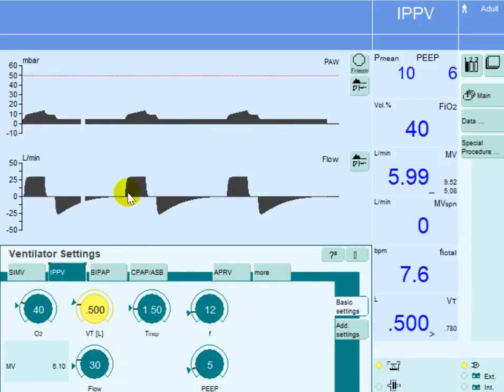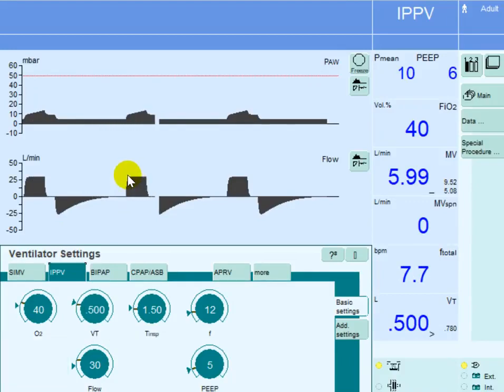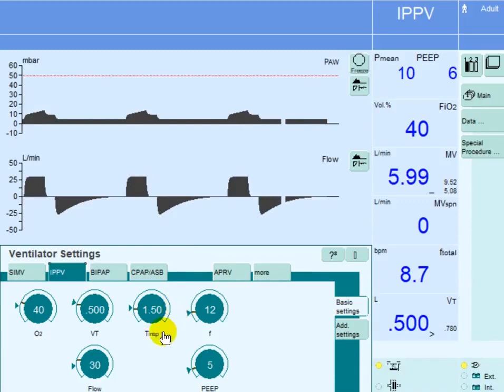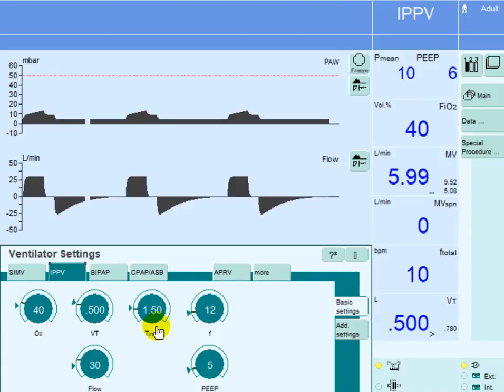The flow will go up to 30 liters and will stay at 30 liters for the duration of the inspiratory flow time. We set the cycling mechanism as time, and the inspiratory time here is 1.5 seconds, meaning that inspiration will last for a total of 1.5 seconds.